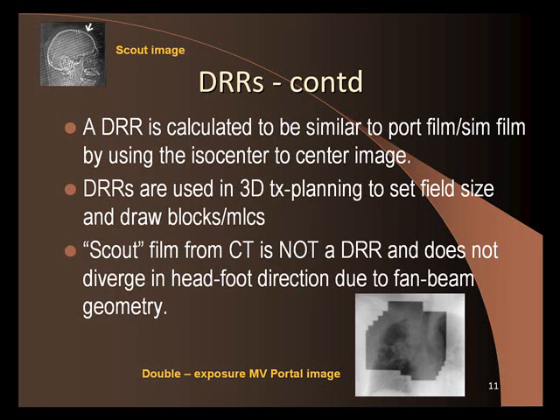Okay, so kind of like before when we did the simulation and the physician drew blocks, well now the physician is going to draw blocks on the computer screen from the DRR. Okay, so that's kind of like the new X-ray. DRR is a new X-ray. Up here, there's a faint image of a scout image.